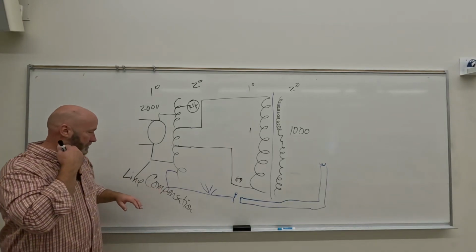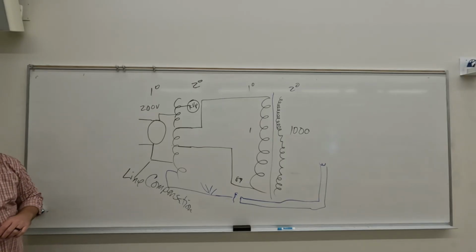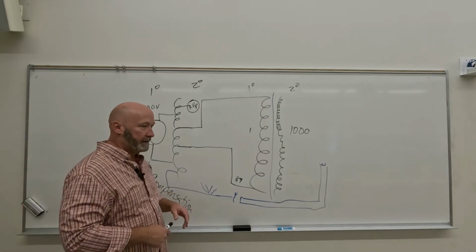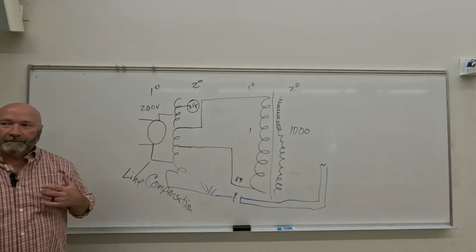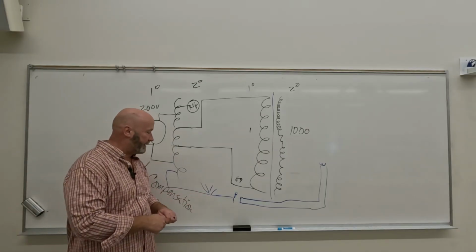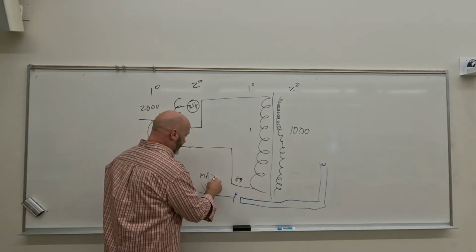Okay. So we've got kilovoltage at this point, or the capability of creating kilovoltage. What we've got to do now is create mA. That's probably where we're going to end. I don't think we're going to get into timers. So we have to have mA. So we've got, again, another rheostat down here. That's your mA selector.